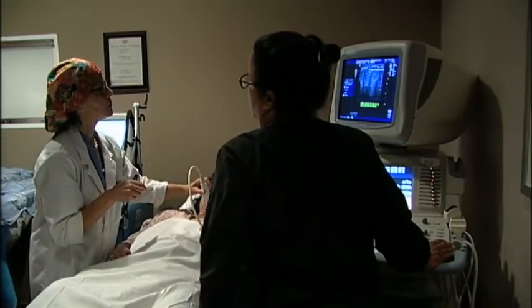Clinical trials, as a rule, don't make huge leaps in how we treat cancer. Everything is done in baby steps. But if you look back, initially we were doing mastectomies for breast cancer, then we started doing lumpectomies. We used to do these big radical lymph node dissections to see if the cancer has spread. Now we're not doing that anymore. And so obviously this is taking this into the next step in treatment, no longer doing lumpectomies, but allowing the patients to be treated minimally invasive with a laser probe.